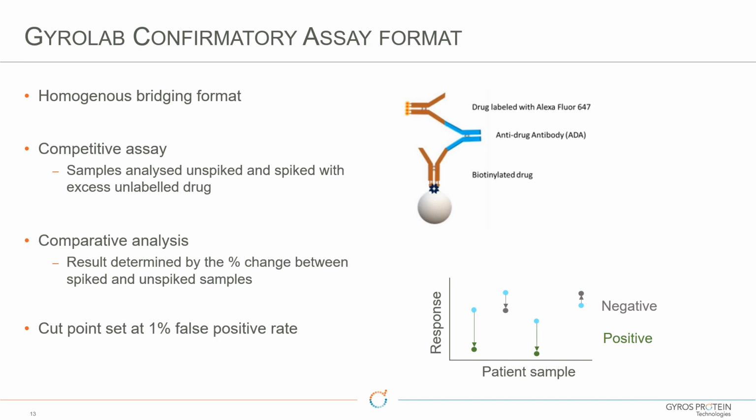And when you do your confirmatory, you also add with and without drug, so you can see that the sample still screens positive as well. Because there is a lot of difficulty when the sample is just above the screening cut point. When you reanalyze it, it can then screen negative, for example. Right, it's the nature of a semi-quantitative assay.